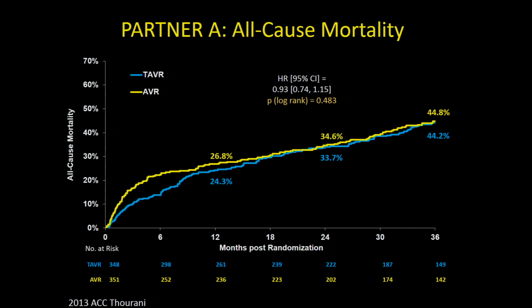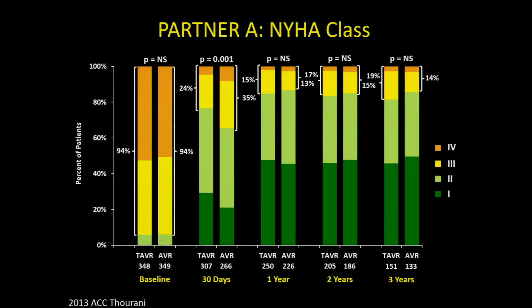So in this study, we called this, the TAVR was quote unquote non-inferior to surgery. In subsequent studies, it's actually been superior to surgery. Don't tell Dr. Jessen I said that. At least in short-term data. So we can rest assured that in the appropriate patient population, we're not skimping on the treatment. We're actually giving it equal, if not better, in some instances, therapy for these patients.